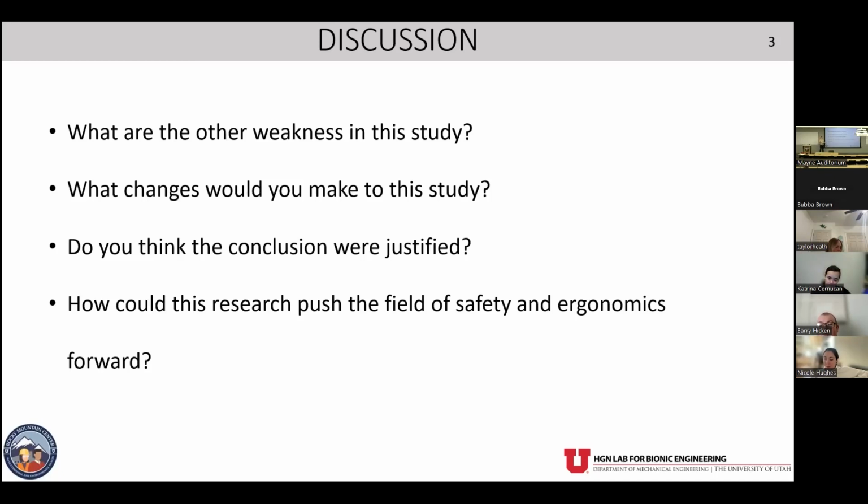So that's a really big burden on the researcher. If you have this exoskeleton and you want to evaluate it. Yeah, it's very difficult, but we do see in our testing in the lab that people get better typically. Sometimes you'll see that even within one 6-minute walking segment. So what you'll try to do is have someone walk for a little bit, rest, walk for a little bit, rest, walk for a little bit less, and then maybe have them come in the next week after you've retuned your controller, and you see what I think is the maximum benefit I'm going to get out of here, and that takes a little bit of intuition. But yeah, that's a super big topic in the field on how to handle it, and I think there's not really a conclusive way.